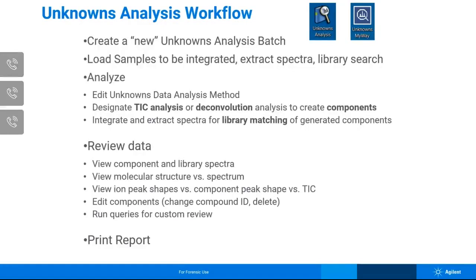Now, a batch is basically a file, a directory, where you're going to place the samples of interest that you want to analyze. Now, these samples can be case samples, they could be standards, they could be blanks, they could be continuing calibration files, they can be matrix blanks, spikes, all kinds of things. Anything that you can generate on your system can go into a batch.